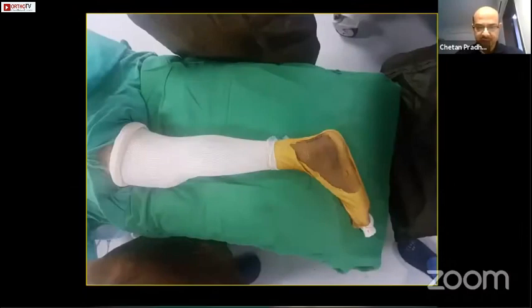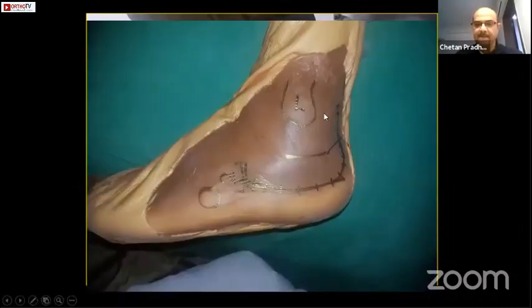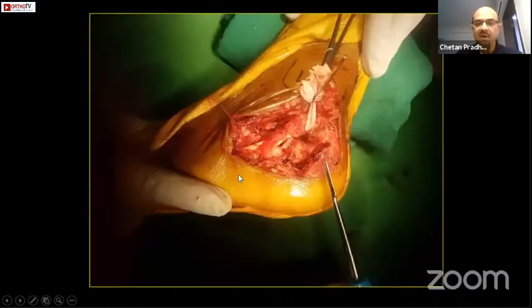I do it in a lateral position. The incision is midway, slightly posterior than the midline, between the lateral malleolus and the tendoachilles, coming down to the junction of the sole — an important landmark for a broad-based flap — then going horizontally to the fifth metatarsal. Raise a full thickness flap, do not dissect between the skin, retract the peroneal tendons up, and pass two K-wires: one in the lateral malleolus and one in the cuboid. Bend those K-wires anteriorly and don't touch this flap at all. There should not be any retraction of this flap with a retractor during the entire course of surgery. Remove these K-wires at the end of surgery only.